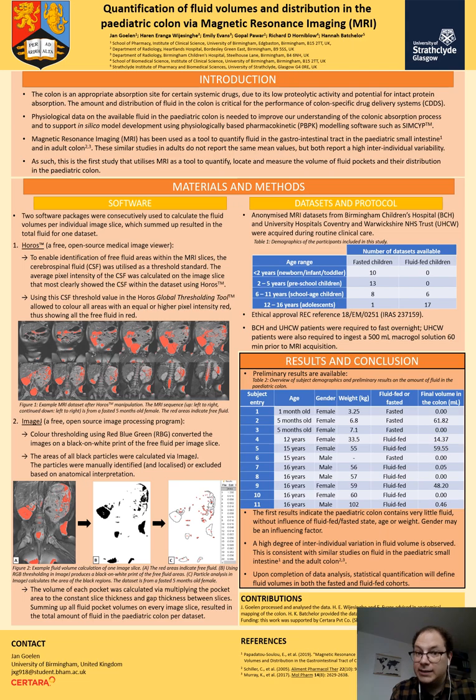After processing the datasets in HOROS, we open the individual slices in ImageJ. Here we filter the image slice on red color and print a black and white image, so we get a clear print of the fluid zones, which are now colored black. Next, we use the particle analysis tool to calculate the area of these black zones. After this, we manually exclude or include these regions of interest and determine where in the colon they are located, taking into account the three-dimensional anatomy of the intestinal tract. So we look at the next and previous slice within the dataset.